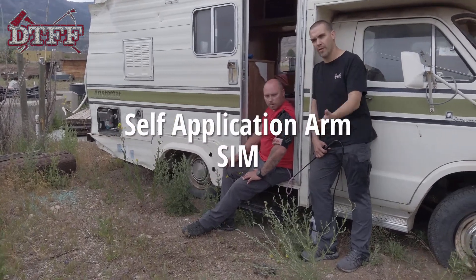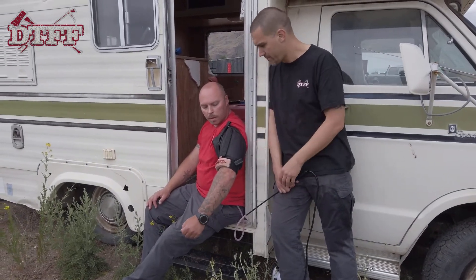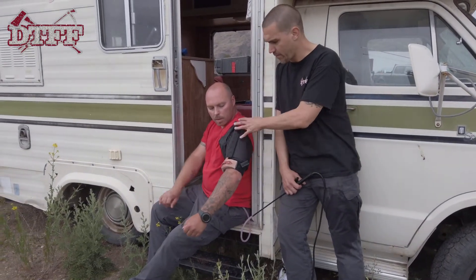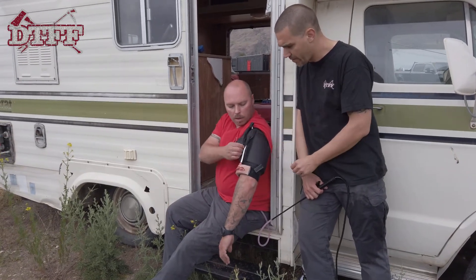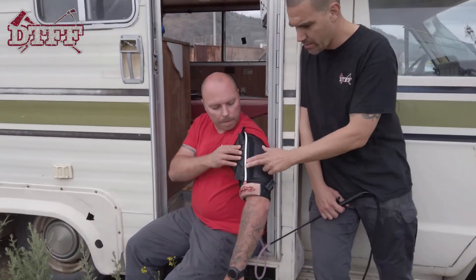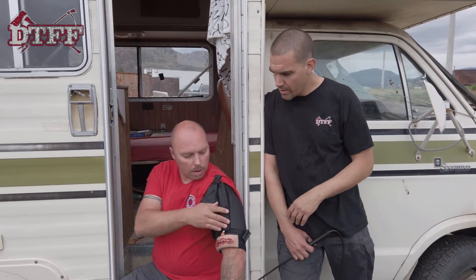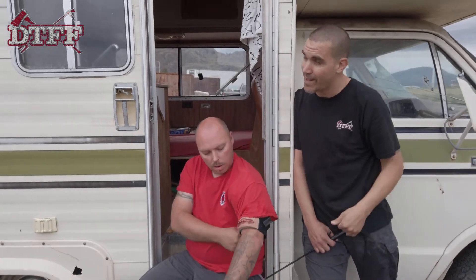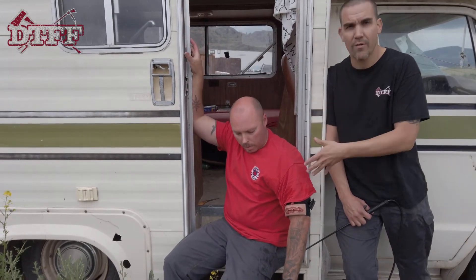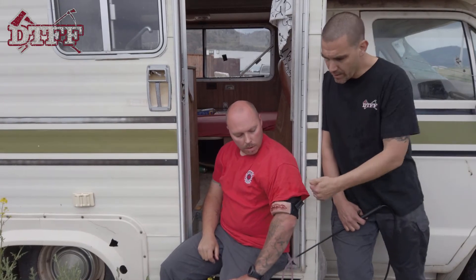We've attached the TrueClot tourniquet to the arm injury, strapped onto Todd's arm. Inside there's a small soft tubing that, once the tourniquet is applied, will stop the blood flow. This is a scenario where we could be teaching a civilian — we're in one of our RVs used for training. Maybe he was out camping, chopping some wood, and somehow severed his artery.